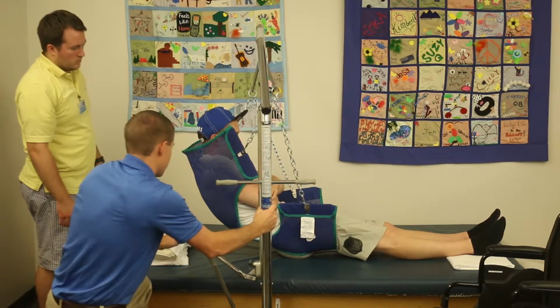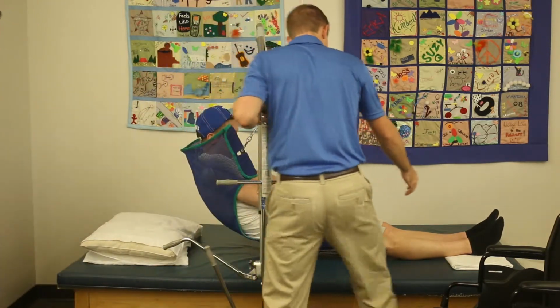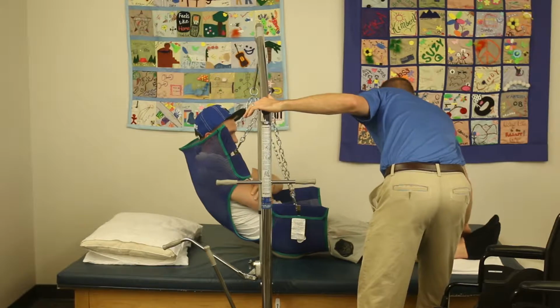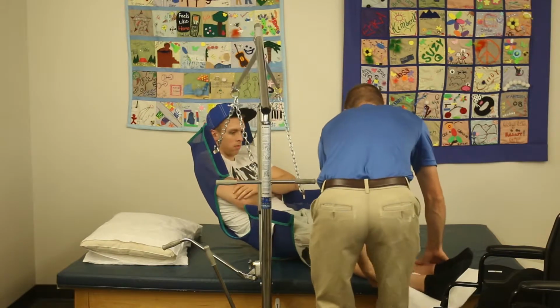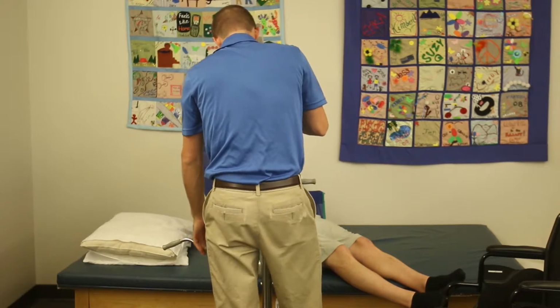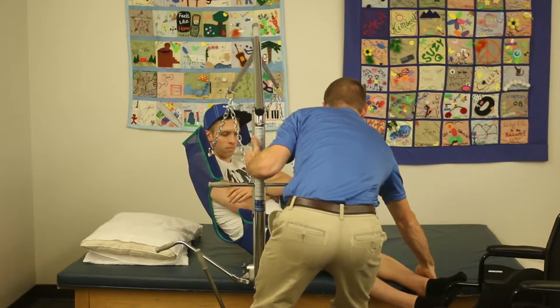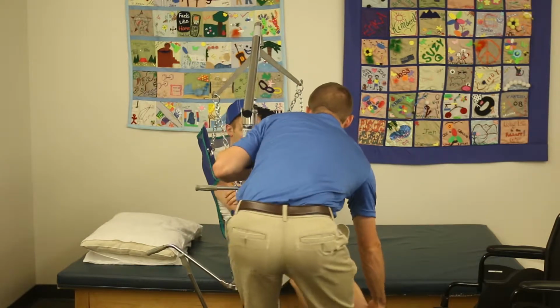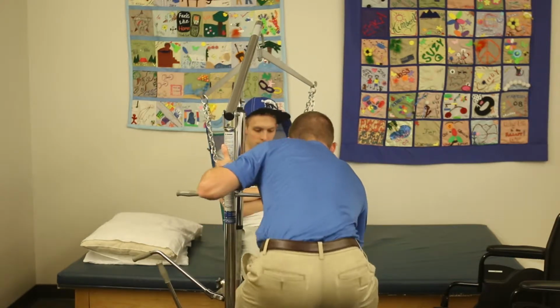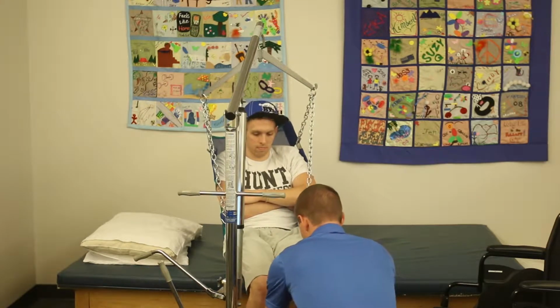All right. That feel okay? Okay, so I'm gonna slide your legs around here towards me. Perfect, let's keep them there. Unlock you real quick. Slide you back. All right, so bend your legs there for me. Just get them right up on the inside there.